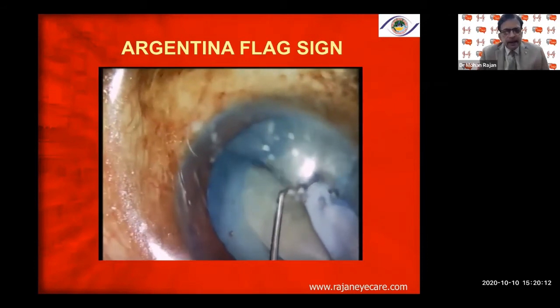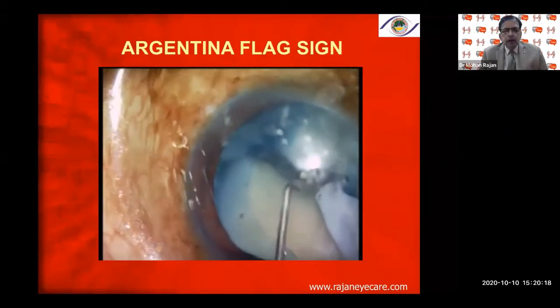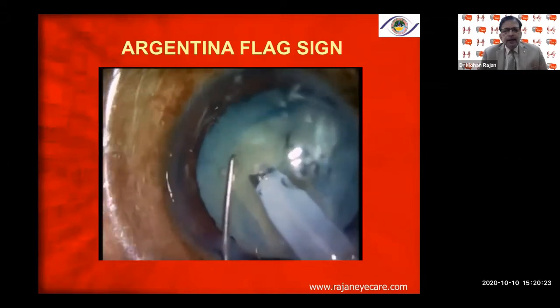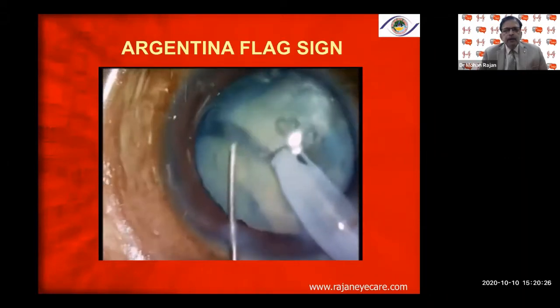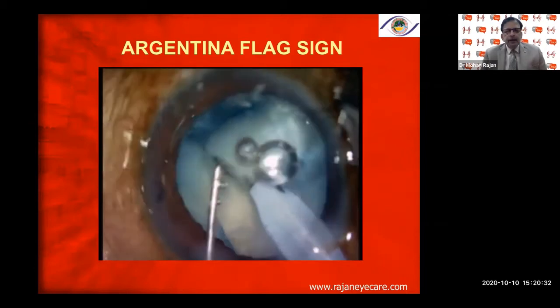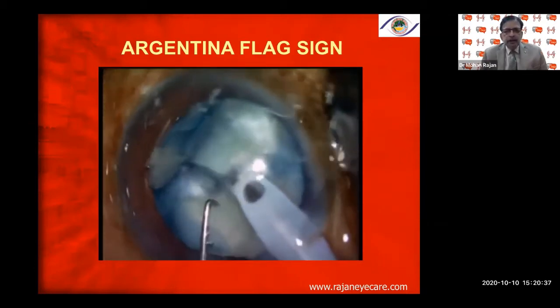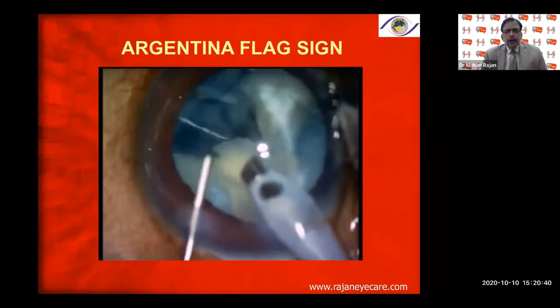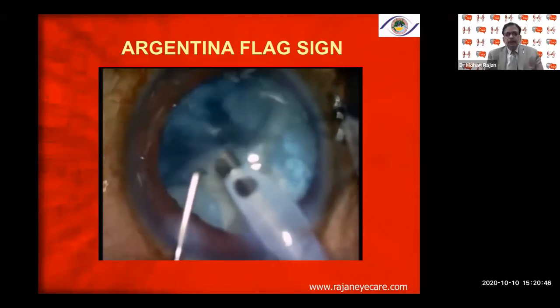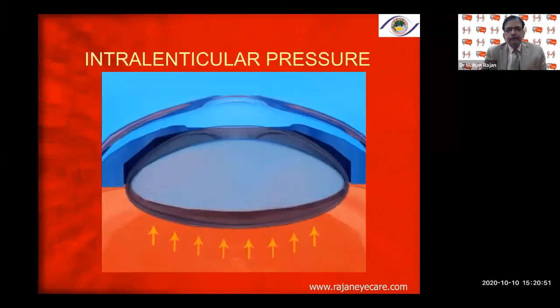I'm using a direct chop technique — this cataract is not very hard. Using direct chop so there is no stress on the zonules and no stress on the posterior capsule. Bring the cataract up a little into the iris plane, making sure the corneal endothelium is well protected with Viscoat, and proceed with phacoemulsification without stress on the zonules and the capsular rhexis margin. The patient did very well.